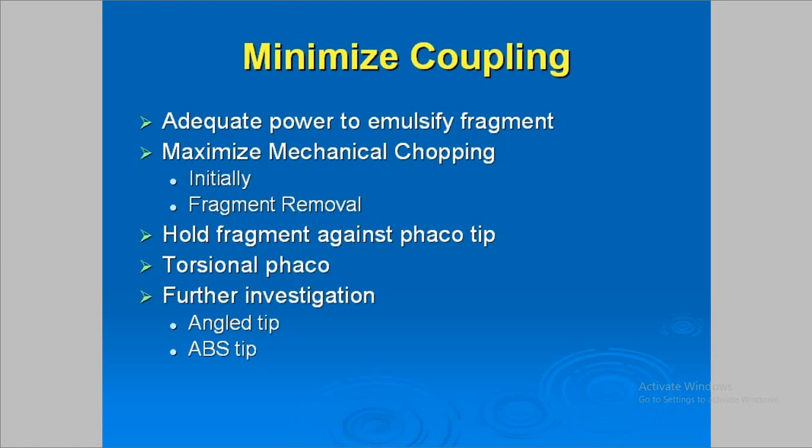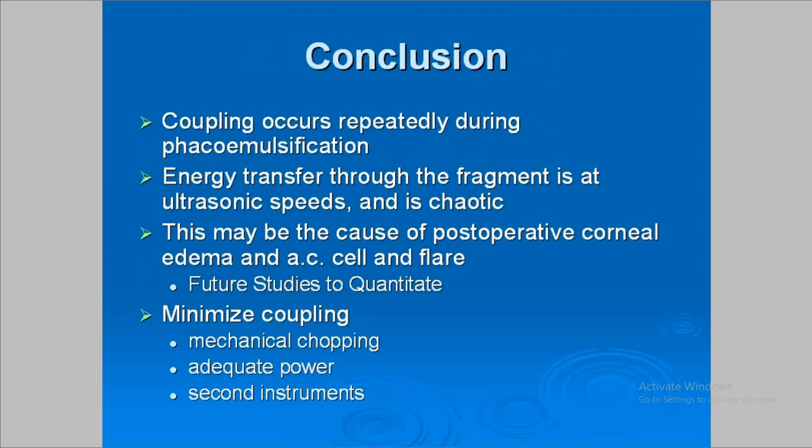And then we need to look at angle tips and ABS tips, which I haven't done yet, to see if these have a role. And so finally, if we can control these things, hopefully we can decrease corneal edema.